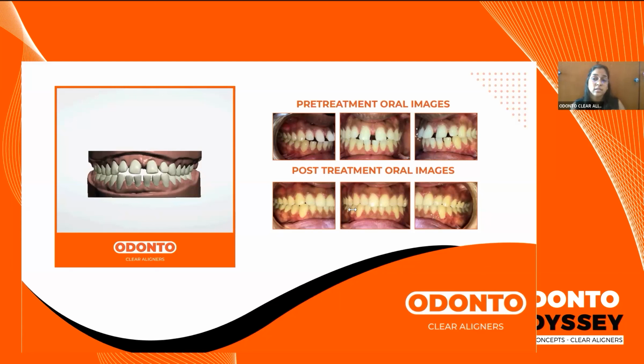Or if you are hesitant to use a burr right from the start for breaking the contact, then you can always use a proximal strip which is available to break the contact between two teeth, and then you proceed with the burr. You just have to ensure that you're performing your proximal reduction perfectly, not trying to perform it at a slant or at an angle. So it always helps to break the contact either using a strip or a thin burr, and you can just have it run vertically across. Like if the teeth are at an angle, then you have to ensure that.